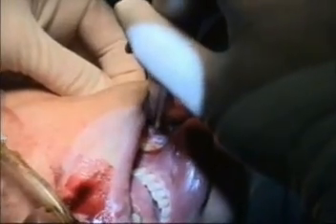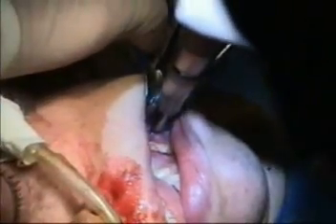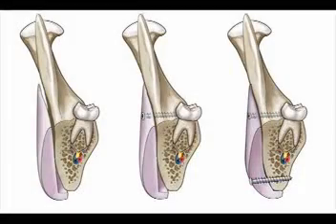They allow in-place contouring of the implant, and perhaps most importantly, they obliterate any dead space between the implant and the native mandible. Any gaps between the mandible and the implant are ultimately read as unwanted increases in augmentation.